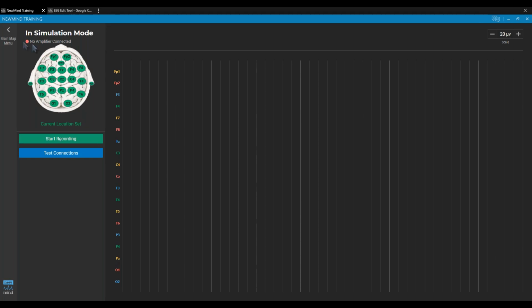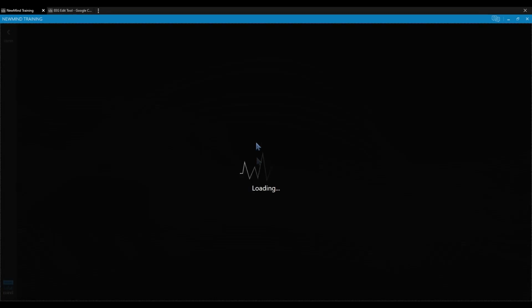So I tried during a map to turn off auto artifact. Okay. And Andrea, are you using a 4 channel or a 20 channel amplifier? I thought it was 19, but yeah, we call it 20 because we include ground in that. So with ground, that's 20.